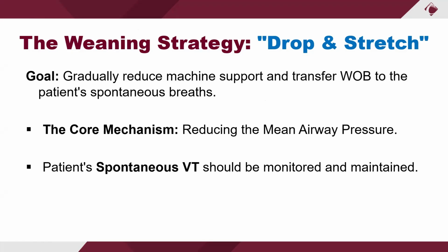So you're keeping mean pressure in there to keep that lung recruited. The mistake sometimes is that people will use APRV to rescue a patient, and they'll recruit them and make everything perfect. And then they'll want to switch back over to conventional. And again, for years, I'd always say that if you're not going to extubate that patient in the next 24 hours, I wouldn't recommend doing that because they will de-recruit.